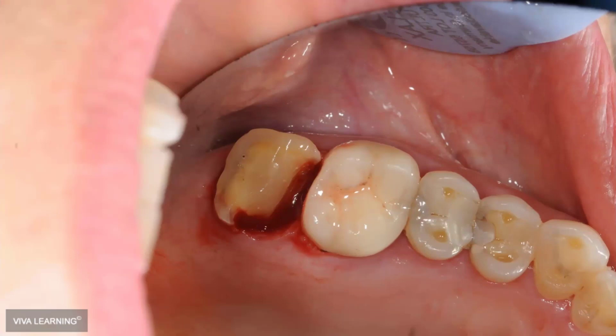This patient came into our office and said that he only has a couple of days to stay here, and he has a tooth that was badly decayed. The destruction is pretty big, and usually in this case I would recommend to do a crown lengthening, and after the healing take the impression, but the patient would leave and come back in a couple of years. So I decided to make an onlay, a hybrid composite CAD/CAM monolithic onlay.